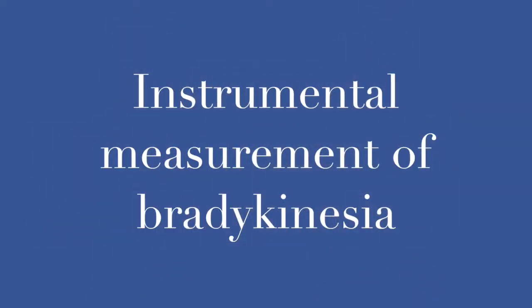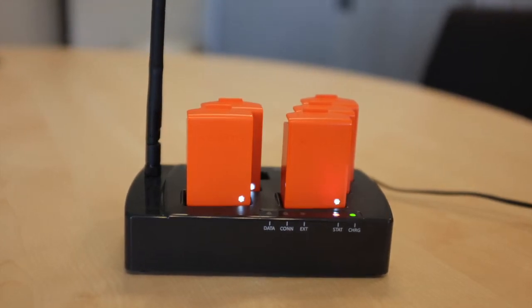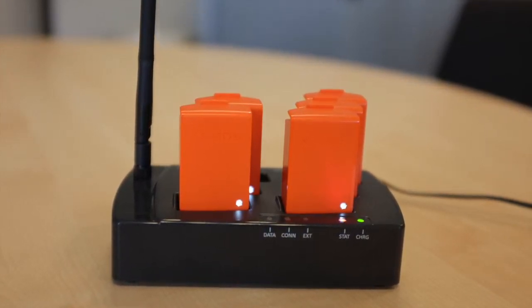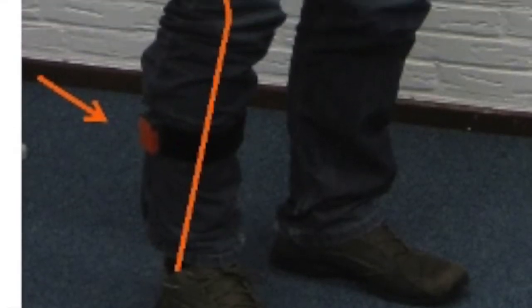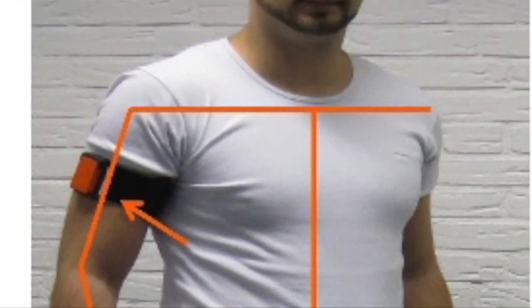Instrumental measurement of bradykinesia. For the instrumental measurement of bradykinesia, the patient has to do four motor tasks. Performance on the task is captured with five inertial sensors. These sensors are attached to the subject's dominant upper and lower arm, leg, and waist.